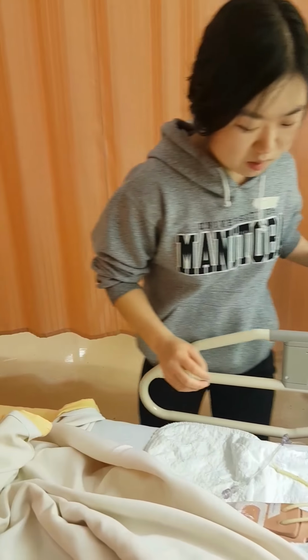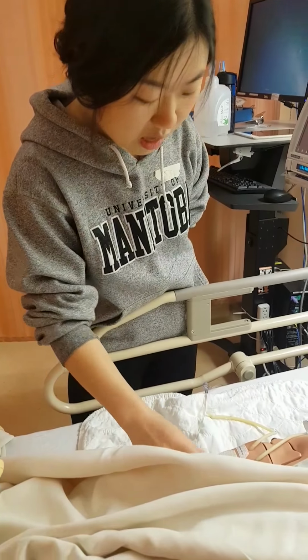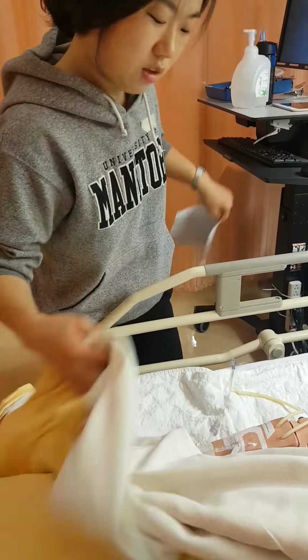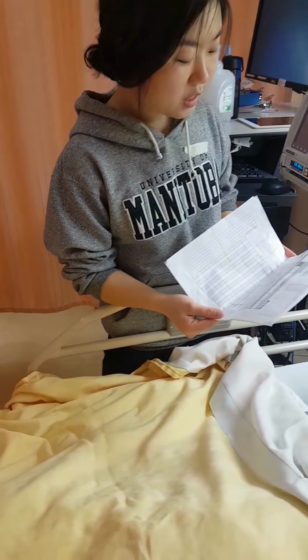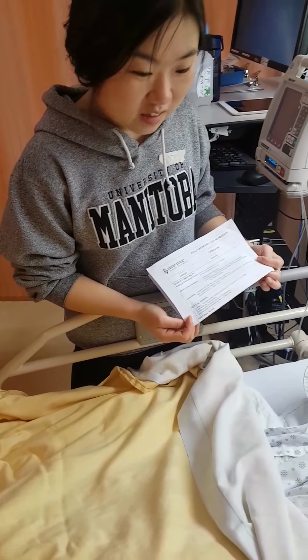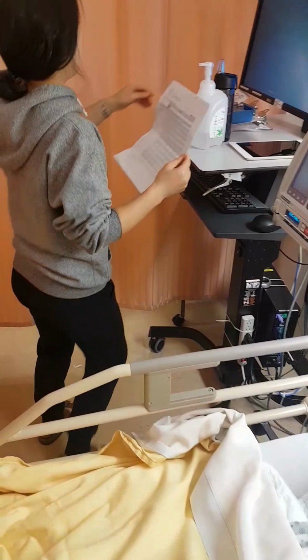Alright, so at the same time, I'm looking at the insertion site to see if there's any redness, warmth, or swelling, and there aren't any. Mr. Smith, are you in any pain or discomfort right now? No? Alright. So the drug that I'm giving you today is called Ceftriaxone. It's an antibiotic, and it's to help treat your respiratory infection. Some side effects are nausea, vomiting, and dizziness, but these are normal. I'm going to start preparing your bed now.